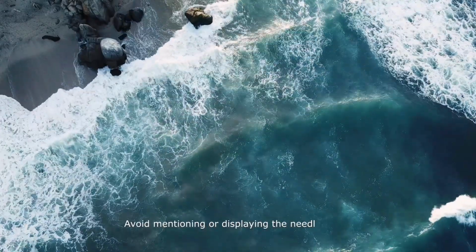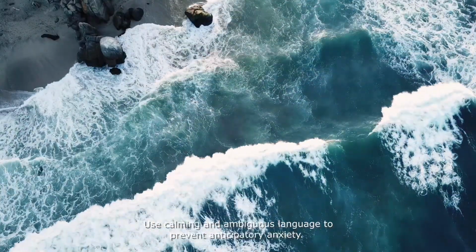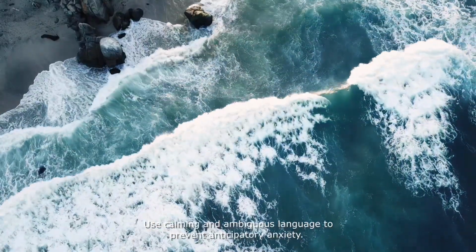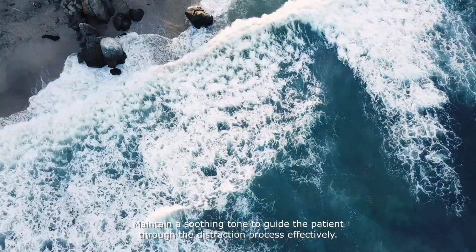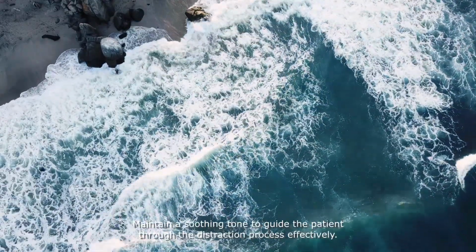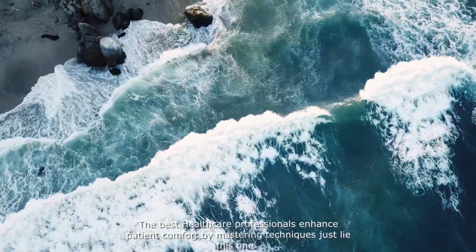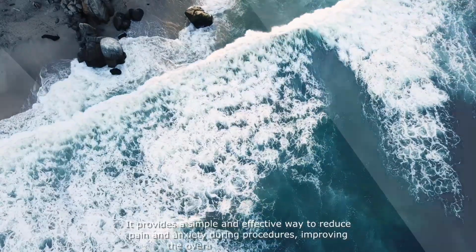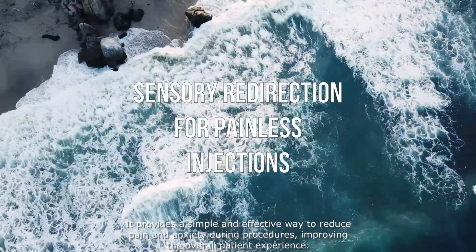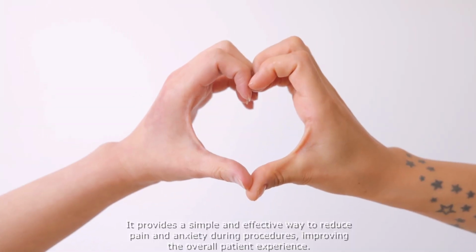Avoid mentioning or displaying the needle to the patient. Use calming and ambiguous language to prevent anticipatory anxiety. Maintain a soothing tone to guide the patient through the distraction process effectively. The best healthcare professionals enhance patient comfort by mastering techniques just like this one. It provides a simple and effective way to reduce pain and anxiety during procedures, improving the overall patient experience.